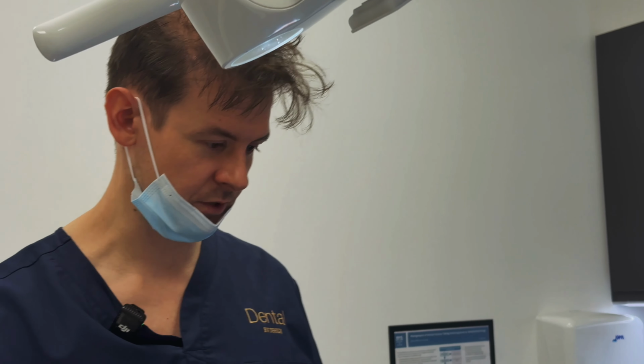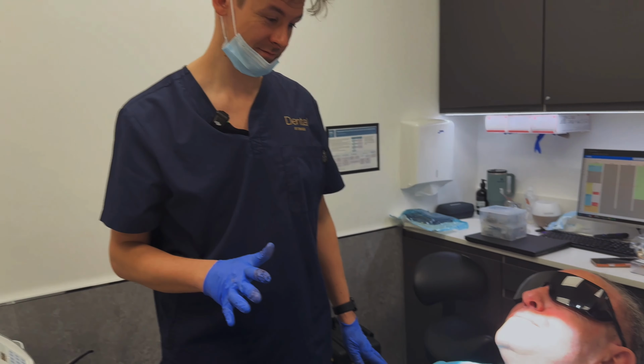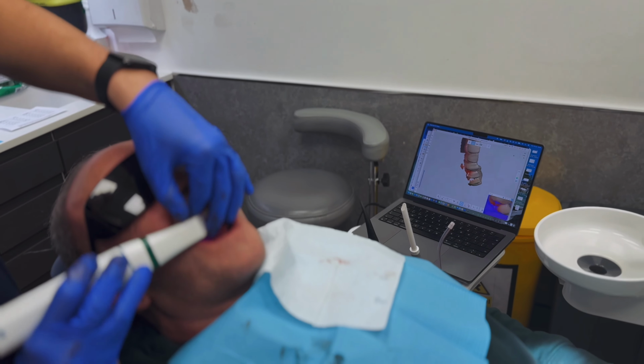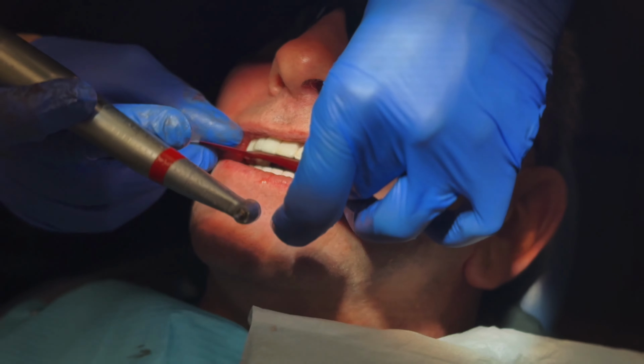The implants went in solid. And number 2, the bite is like 95% there. So now we're scanning the upper arch and the mouth, just to share with our technician any adjustments that need to be made before we move to the final.